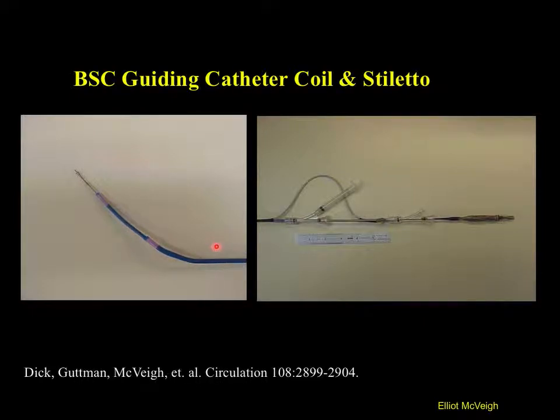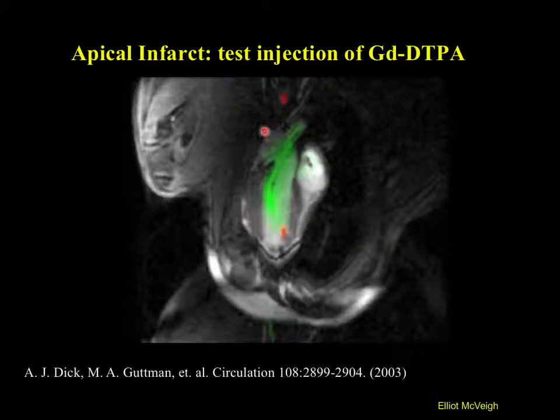It's too bad. But anyway, we laid a very thin wire inside this catheter and turned it into an RF antenna inside the person's body. And we connected that RF antenna here to a receiver amplifier in the MR scanner. So the MR scanner just thought it was another coil, right? And then we made an image using the outside body coil. We made an image using this catheter coil, and we put the two together, right? And so there you can see in real time what's going on with this catheter coil.